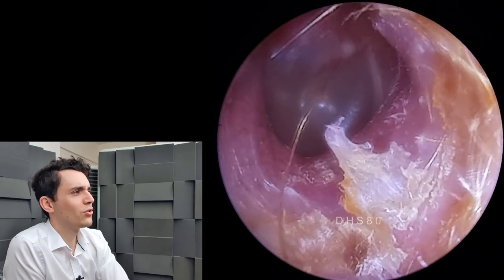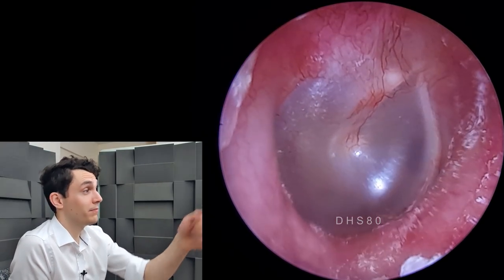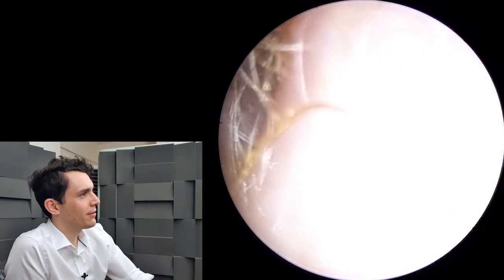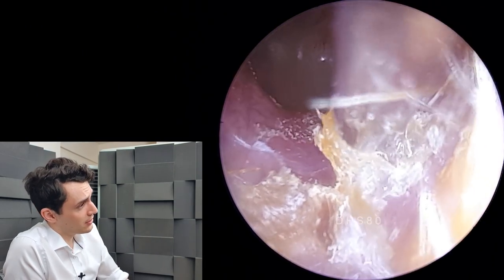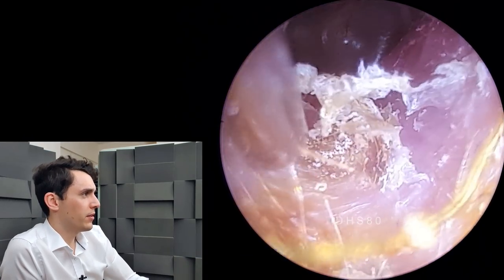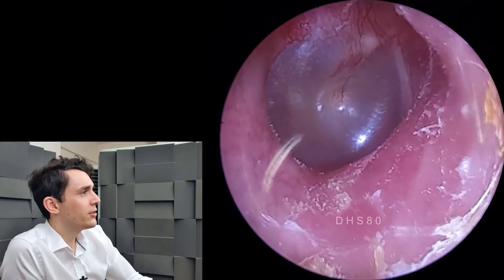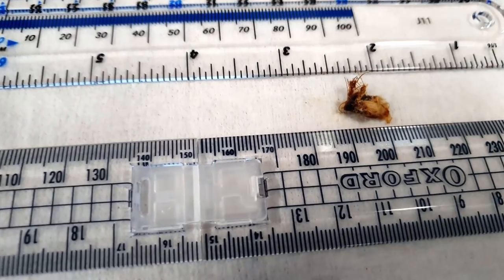And here's the ear. So we have a rather sore ear canal, which is to be expected, given that we were moving around and cajoling it out of the ear with quite considerable force. I'm just going back in here now just to get rid of this last little flap of dead skin. It doesn't make a huge amount of sense to leave dead skin behind if you can get it quite easily — that will help stem any infection. Bacteria like to eat wet dead skin. Eardrum looking fantastic there, so everything's a little bit red, a little bit erythematic, but absolutely fine.